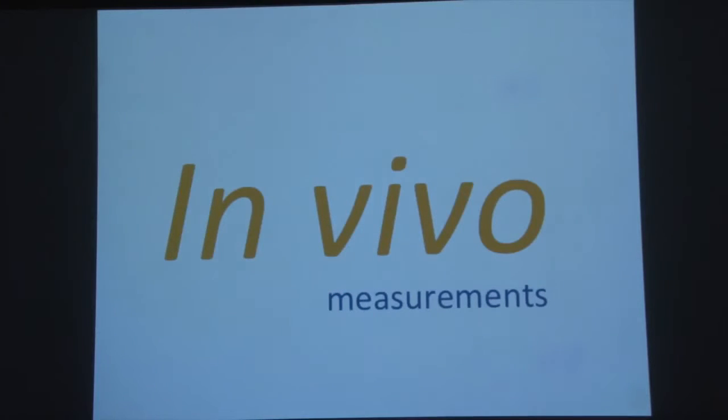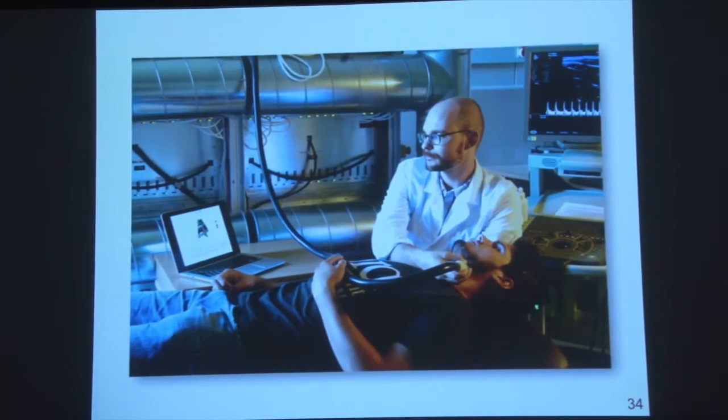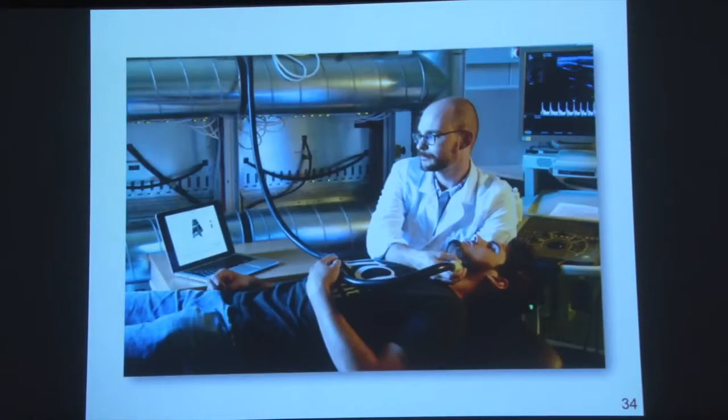So now we'll go to our in vivo measurements. This is an example of our clinical setup. We have a medical doctor, an experienced radiologist, performing the scans. We have a healthy volunteer, and we have the research scanner up here. We also made a scan with the clinical scanner just to see where we are. And this is more for show.